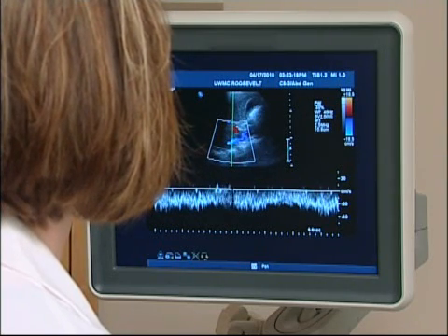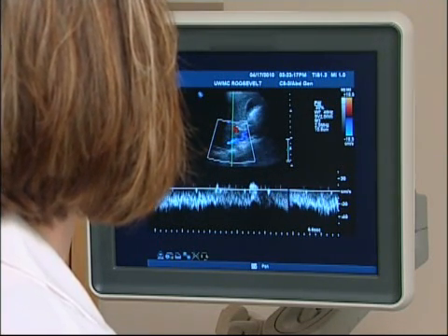This is your IVC. This is blood flow in your IVC — that's normal. This is right before it enters the heart.